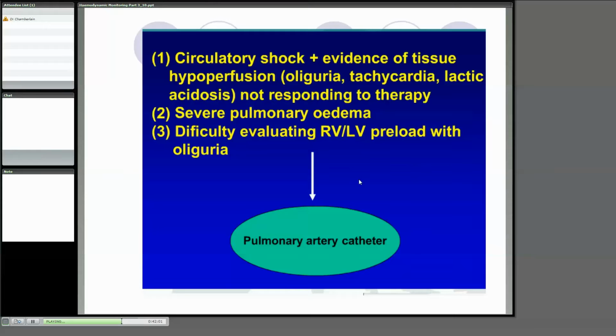and of course then we realise that they're going further down the cascade into organ failure, and maybe they've got oliguria, you know how the urine sort of goes off, and then we probably need something really quite invasive like the pulmonary artery catheter, and from that we can measure all sorts of things. We can also measure oxygenation variables, if you do it properly.